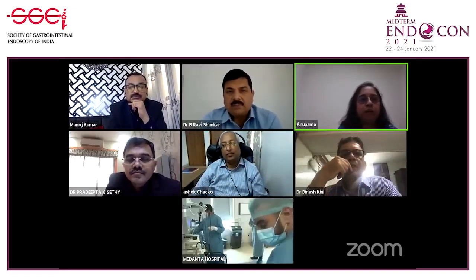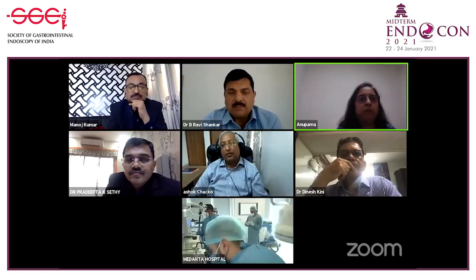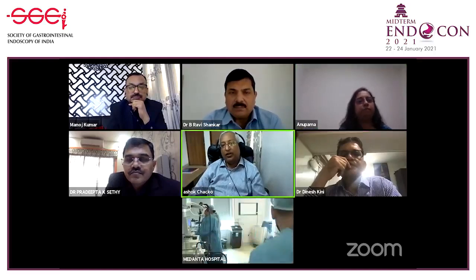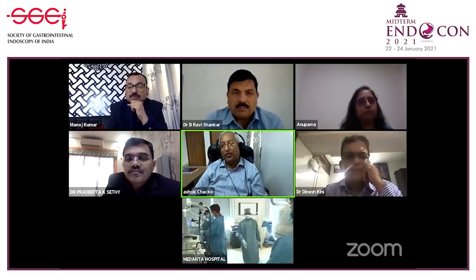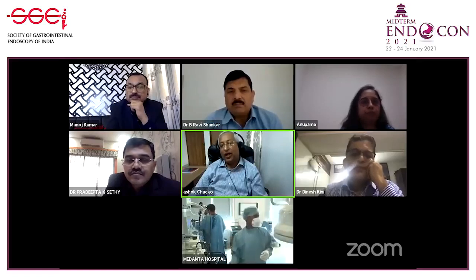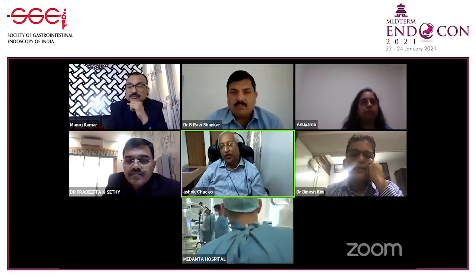But do you always ask for a small bowel imaging before going forward for a capsule endoscopy? Are you worried about capsule retention? It depends upon the situation. Unless the patient has symptoms of subacute obstruction, I have not had any case where there has been a retention of capsule, even in Crohn's disease. So if they have any symptom suggestive of obstruction, then I think we should be careful.